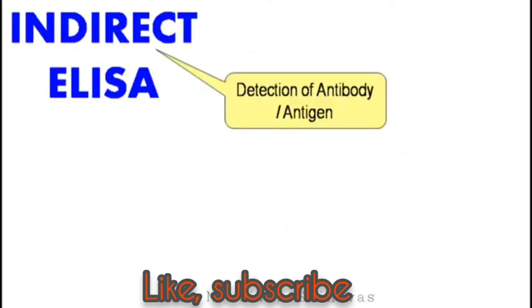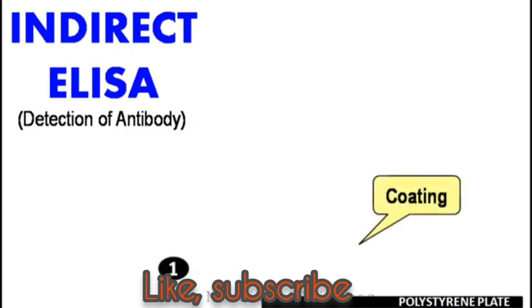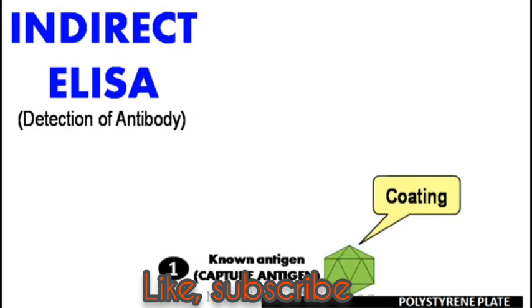Next. Number 2. Indirect ELISA. Used for the detection of antibody, or antigen, but mostly used for the detection of antibody. So now we will see about antibody detection by indirect ELISA. In indirect ELISA, the first step is coating of known specific antigen, which is considered as capture antigen, since it is captured to the polystyrene surface.